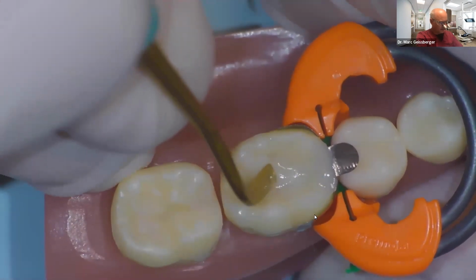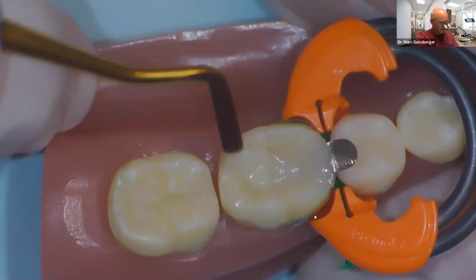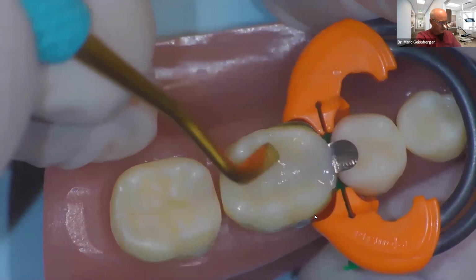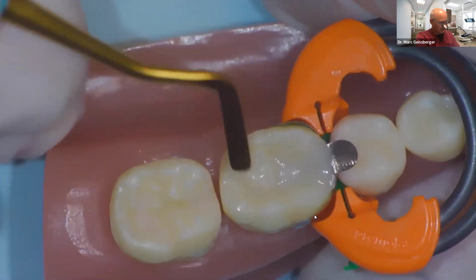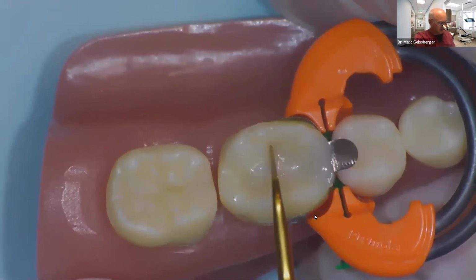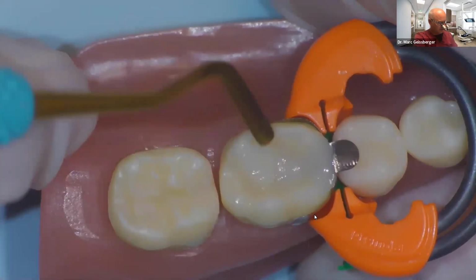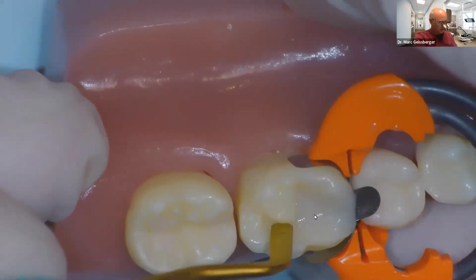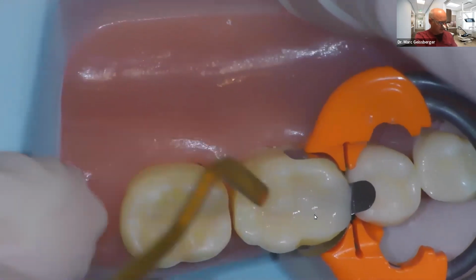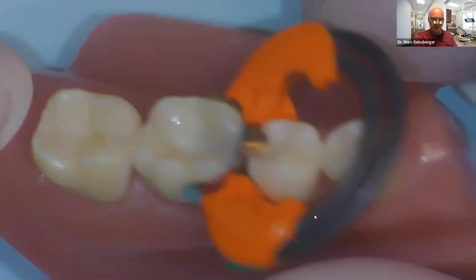And if you notice, I cut off a small piece of composite right here for my distal lingual triangular ridge. And no mirror trickery here. I'm just beveling into the occlusal. I'm trying to maintain this nice straight line here on towards the lingual groove so that we can have a distinct lingual groove. And I want to make sure that my composite doesn't cross onto the anatomy of the buccal. Okay, so I'm really trying to establish that nice groove.